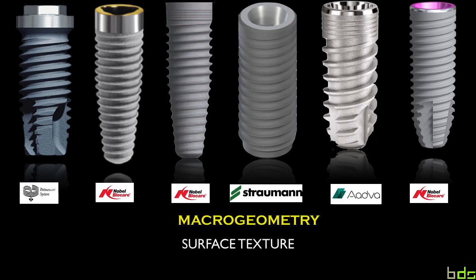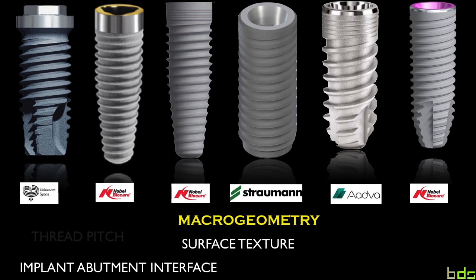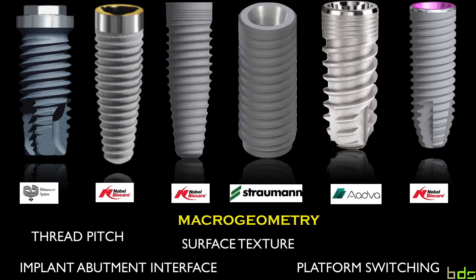So all these implants have different macrogeometries and surface textures. Some are just regular TiUnite, others are SLA or SLActive surfaces. The implant abutment interface is quite different. Each connection is different. The thread pitch is different. Platform switching or not, micro threading or not, all these do have an effect on peri-implant bone. Let's go to the literature and see what the literature says about all these different parameters.